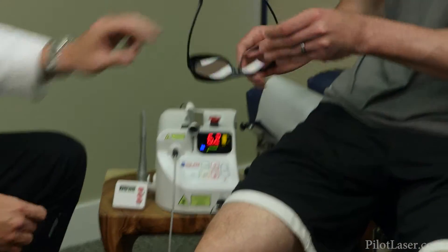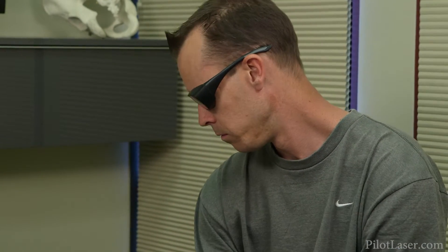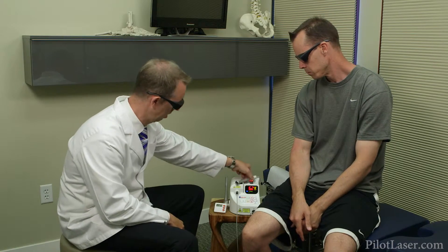Now at this point, remember that before you use the laser, make sure you've posted the laser sign in the appropriate place and that everyone in the room is wearing protective laser glasses.